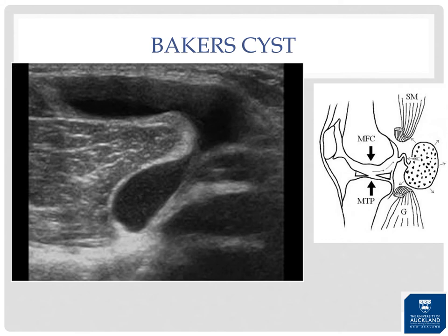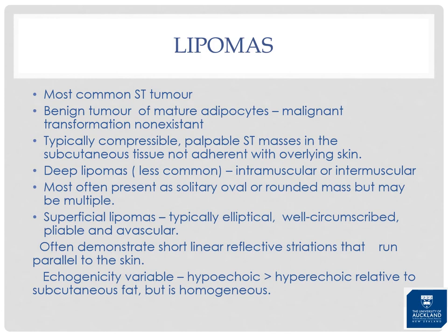Baker's cysts are fluid-filled distended synovial-lined bursae, comma-shaped with a characteristic neck arising between the medial head of gastrocnemius and the semimembranosus tendons via communication with the knee joint. They can cause swelling and pain in the lower leg, sometimes simulating DVT. The cyst may contain solid synovial tissue, and can be inflammatory with particulate material, septations, and loculations visible on ultrasound.